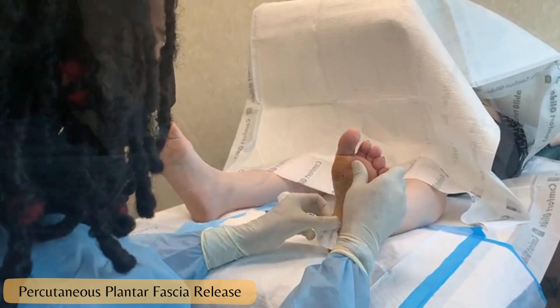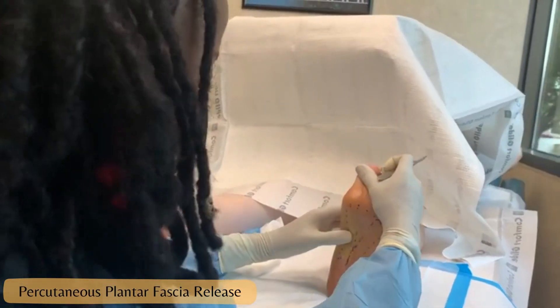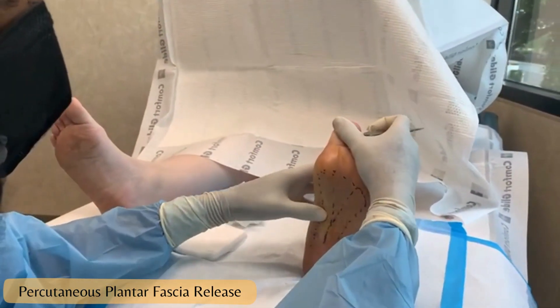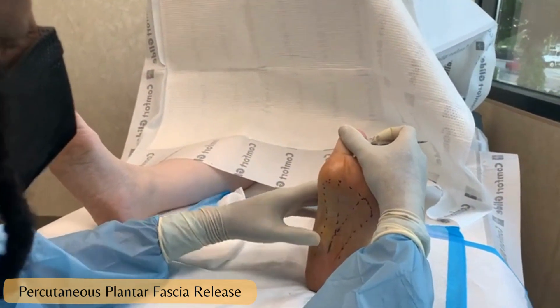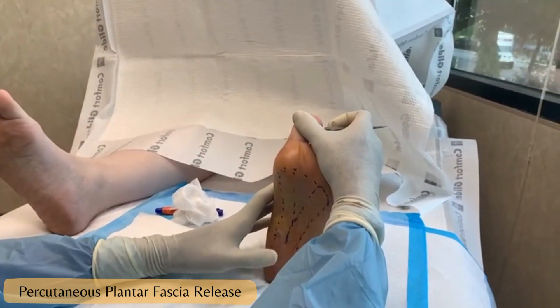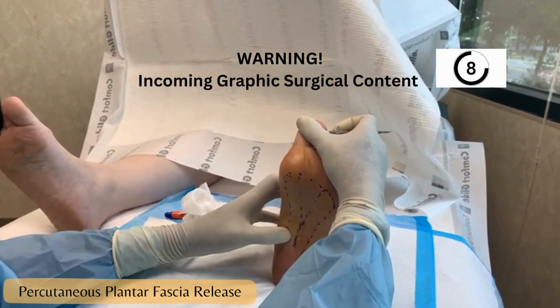Along this area we can feel a very tight medial band. The insertion of the plantar fascia is toward the heel, but if we put an incision there, the patient has a warp in it, you get a scar, and it's painful. So we're going into the arch where the patient shouldn't feel it.